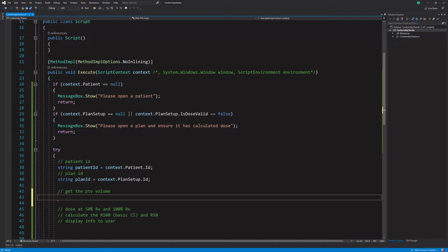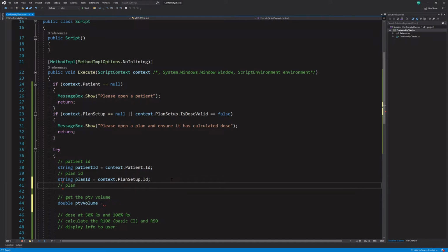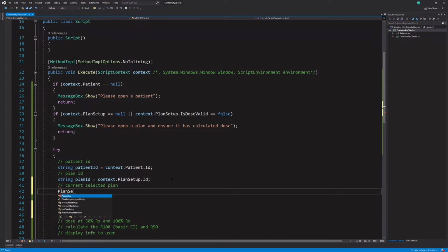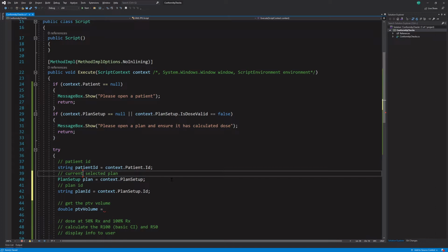So let's get the PTV volume. I think that makes sense. Let's say double PTV volume equals, and actually let's get the plan so we don't have to keep writing context. Plan, the current selected plan. So plan setup, plan equals context.PlanSetup. And if we wanted to, we could really do this. Oops. What I'm doing is holding down Alt and hitting up and down, and that's how I'm moving that quickly. And then here we could just do plan.